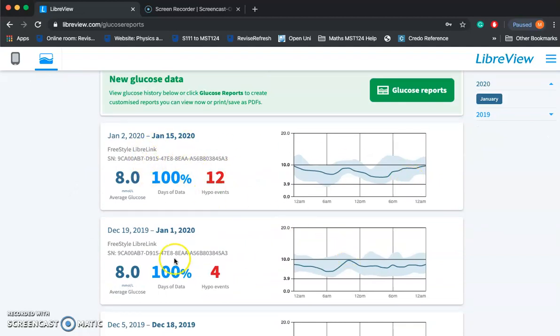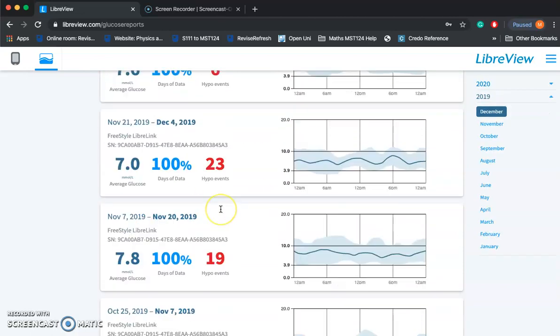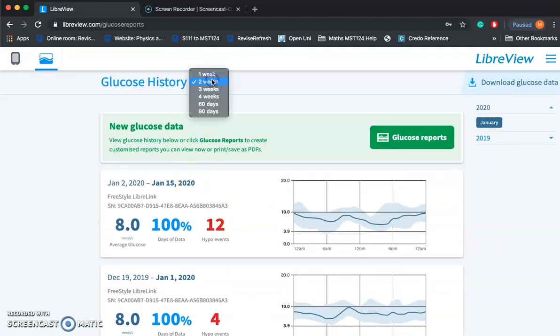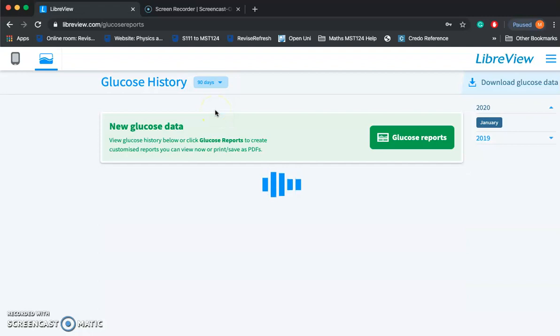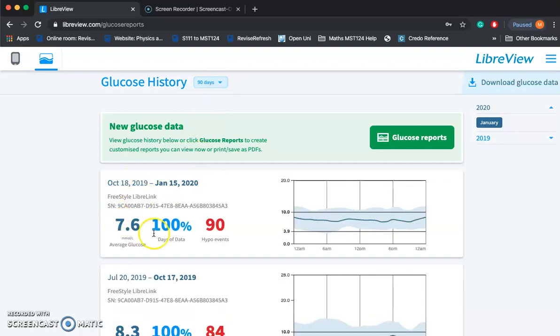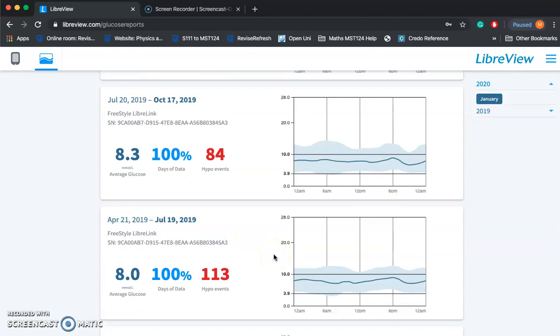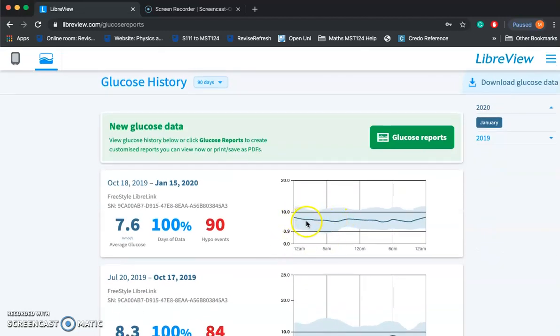The first page gives you two weekly blocks — so the past two weeks. My blood sugar average has been 8, which is not amazing; I'd like to get that back down to the 7s. You can change this to 3 weeks, 4 weeks, 60 days, or 90 days — basically 3 months, which is in line with the HbA1c tested over a 3-month period. Over the past three months, my average glucose has been 7.6 and I've had 90 hypos, which is quite insane — that's 30 a month, almost one a day. The median average line is quite flat, which I'm happy with.